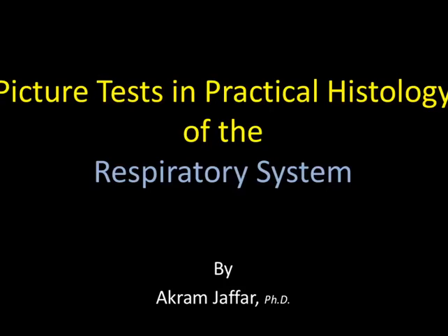This is a picture test in practical histology of the respiratory system. You may use the video as a revision for the topic or as a self-assessment tool. For the purpose of self-assessment, pause the video at the beginning of each slide and take your time in reading the question and coming up with the answer. Then replay the video to confirm your answer and listen to further comments and explanations.